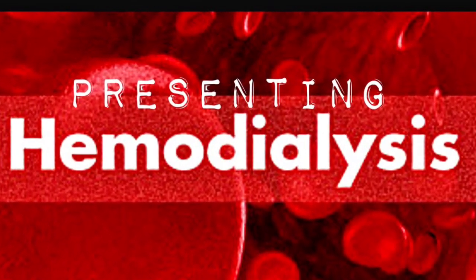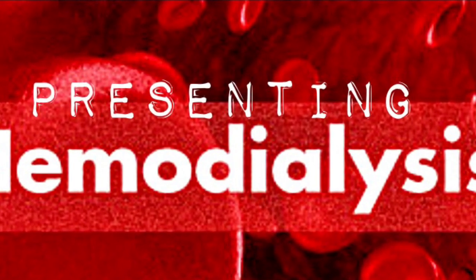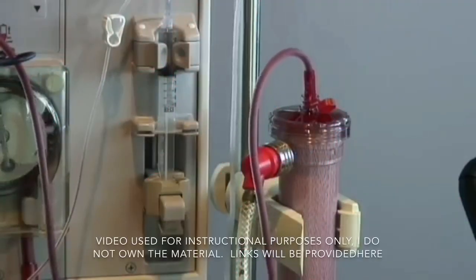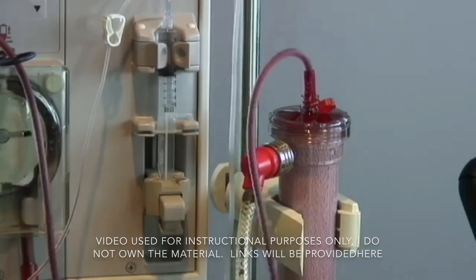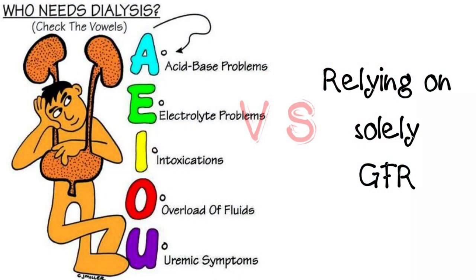Hemodialysis is the most common renal replacement therapy used with end-stage kidney disease and renal failure. It involves passing the client's blood through an artificial semi-permeable membrane to perform the functions of an otherwise healthy kidney, such as filtering and excretion of toxins. It is also a means of correcting fluid and electrolyte imbalances.